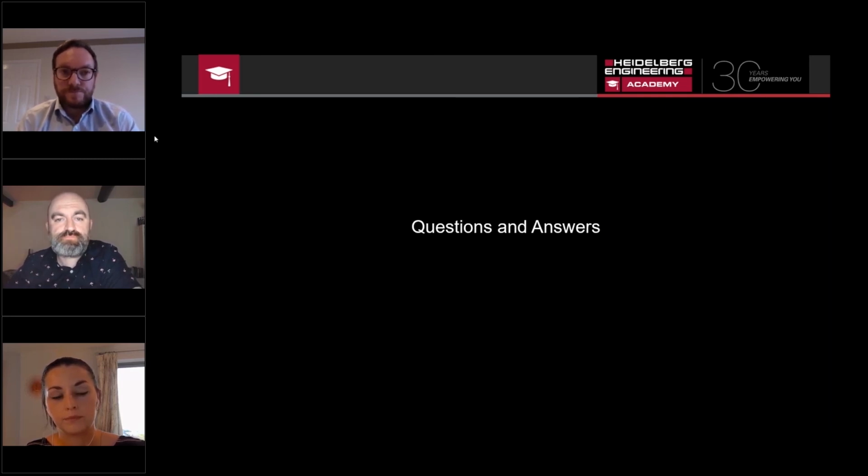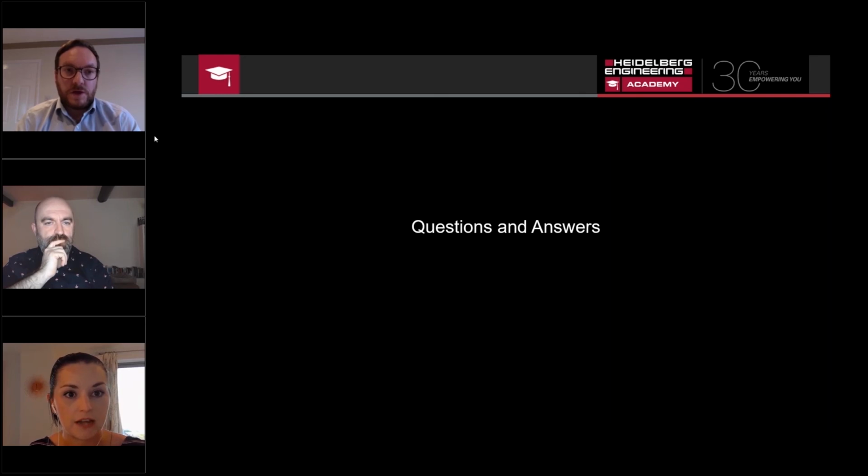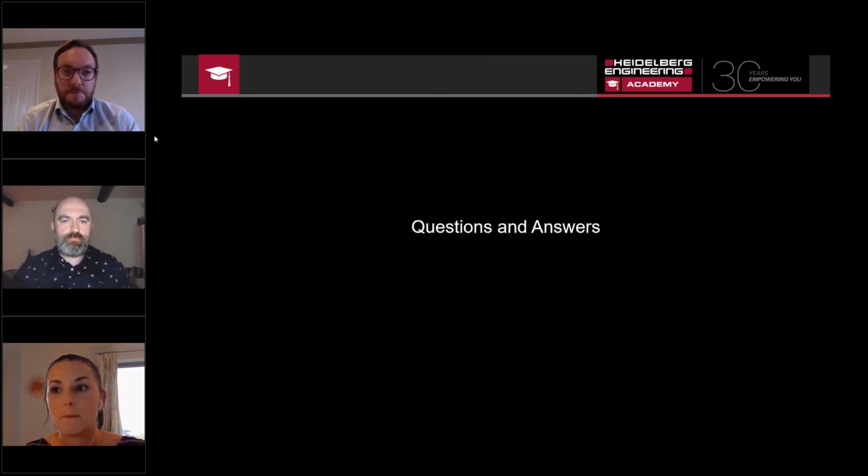Yeah, totally. And then they'd asked how you can change which scan is used as the reference scan if needed. So if you're not sure how to do that on your Spectralis and that's what you're using, just drop us a line and we'll be happy to send you some instructions on how to do that. But you certainly can change the reference scan and reset that reference if you need to and you didn't like the first scan.